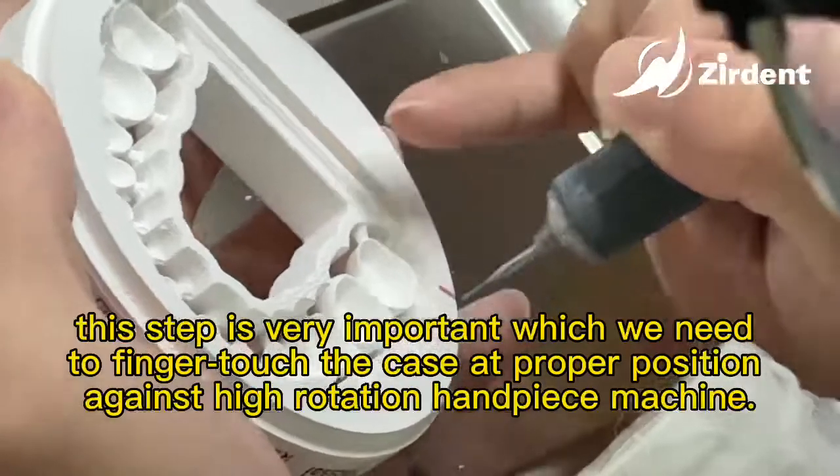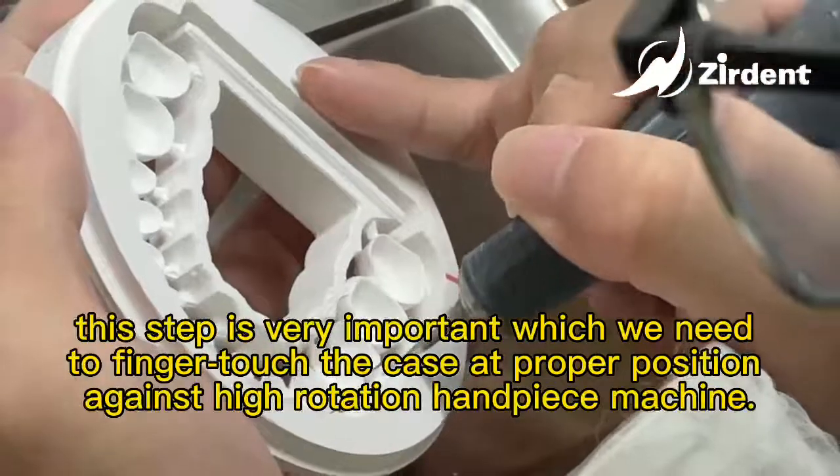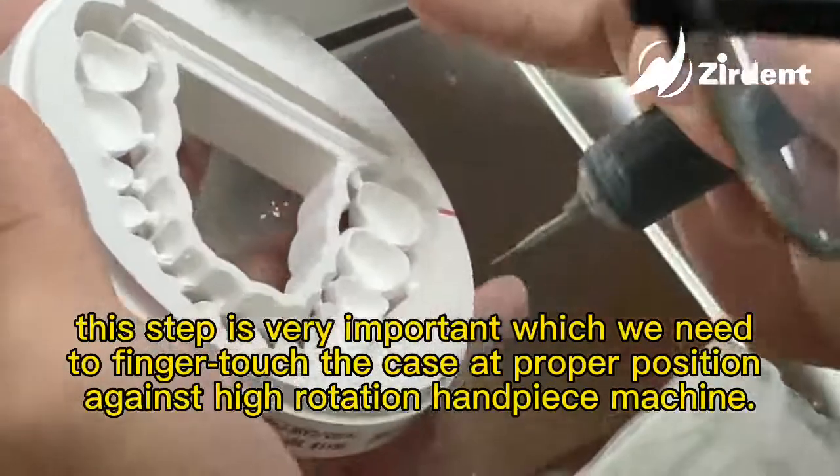This step is very important — we need to finger-touch the case at the proper position against the high-rotation handpiece machine.